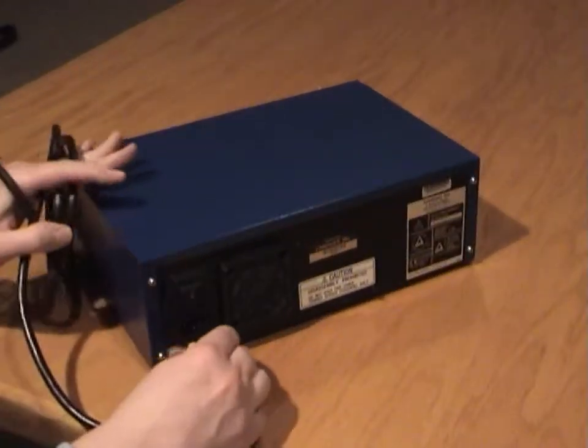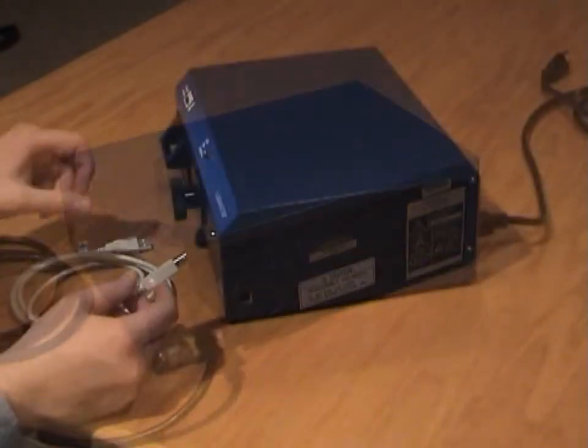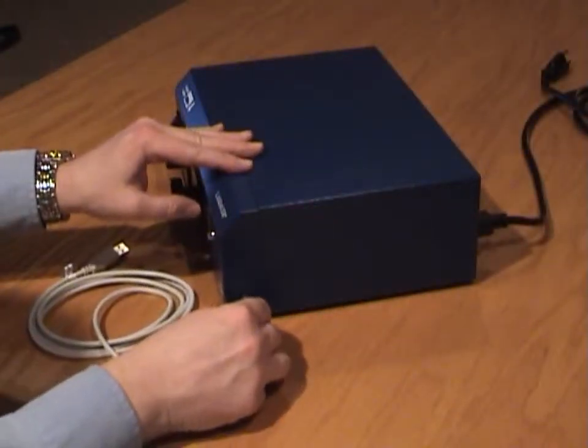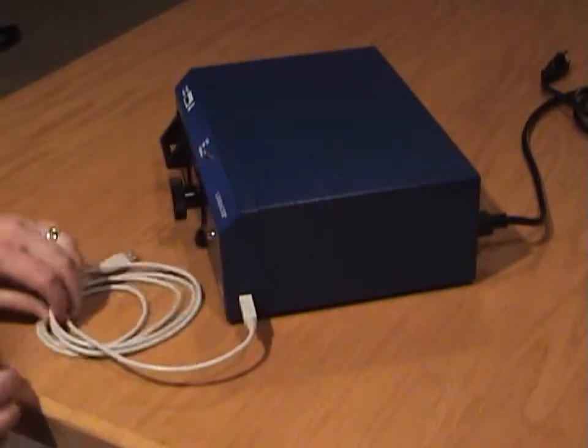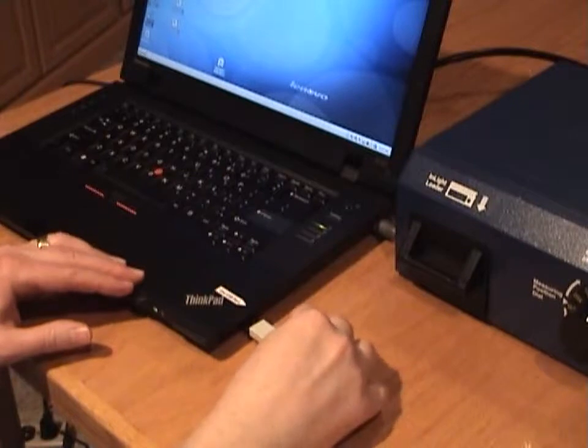Plug the power cord into the back of the MicroStar reader, then into a power source. Plug the USB cable into the side of the MicroStar and turn the reader on. Then plug into the specially marked USB port of the laptop.